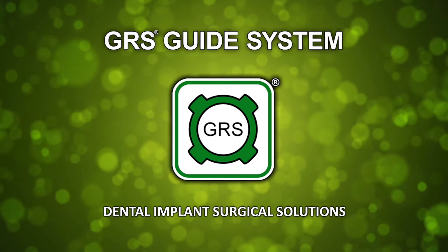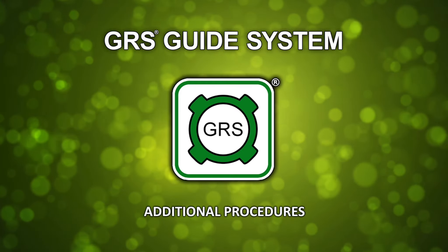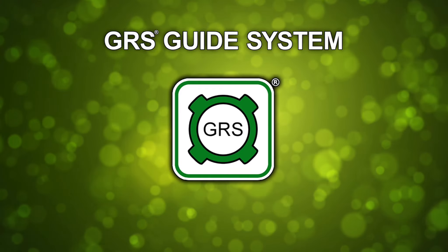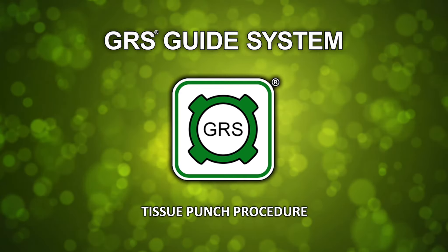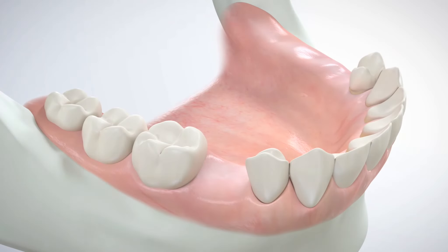GRS Guide System dental implant surgical solutions — additional procedures: tissue punch procedure. As an alternative to a full-thickness periodontal flap procedure, a GRS drill sleeve may be used to guide a tissue punch for initial access to the osteotomy site.